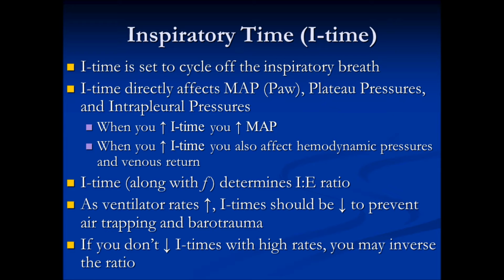So because you don't have enough time to get all that air you just put in there out, you could cause air trapping. And of course, if you trap air, you put the patient at risk for barotrauma.